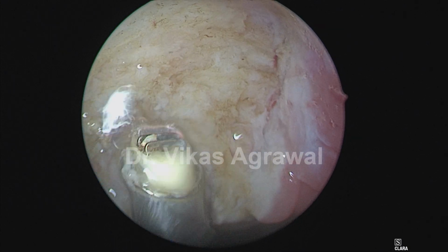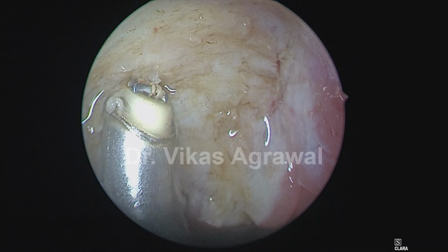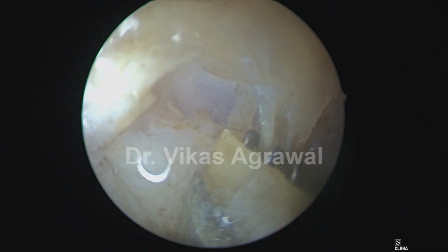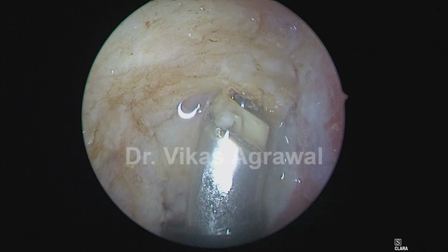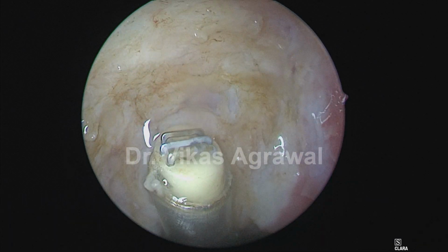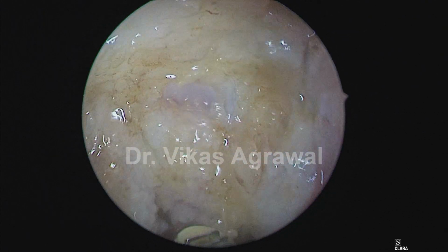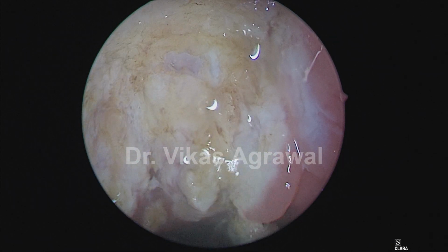Since the child is 13 years old, obviously the adenoids are a little tough. That is the buccopharyngeal fascia. That's the buccopharyngeal fascia. Can you see that? That is the fascia. So we'll remove the lymphoid tissue on top of the buccopharyngeal fascia very carefully without opening up the fascia. That's the fascia. The muscles are not yet opened, and we have no business to open up the fascia and expose the muscles.